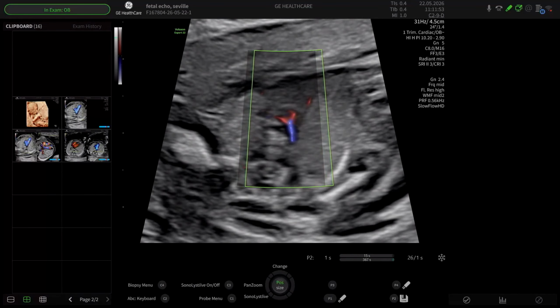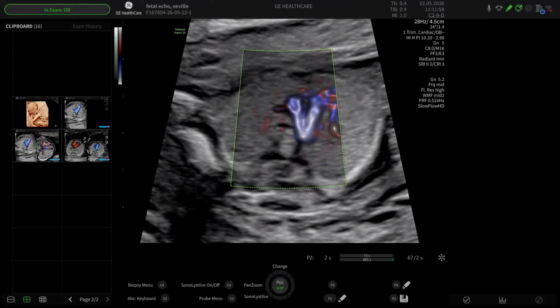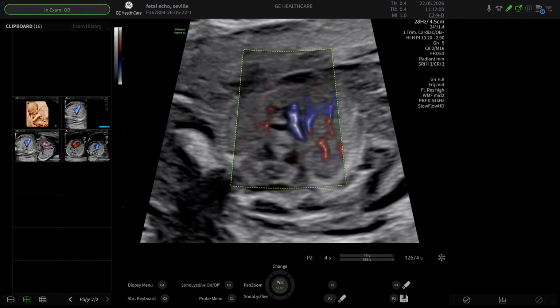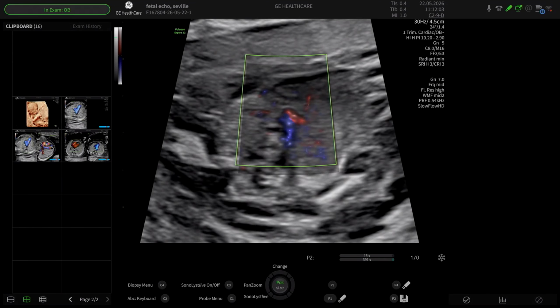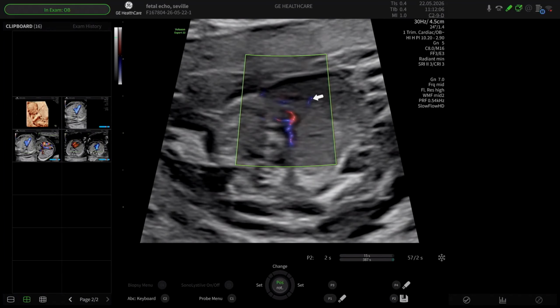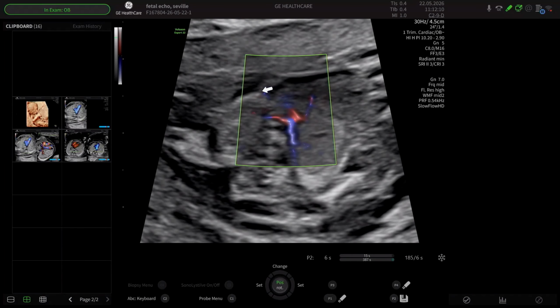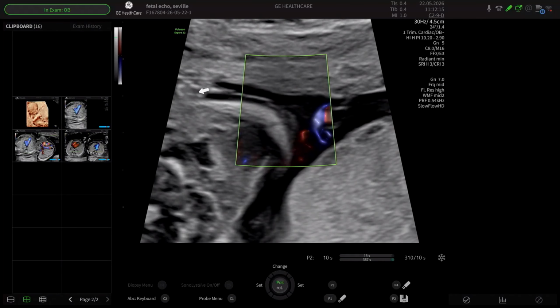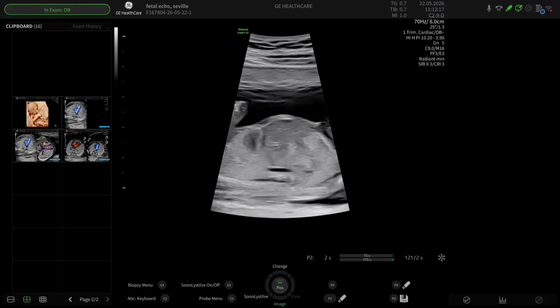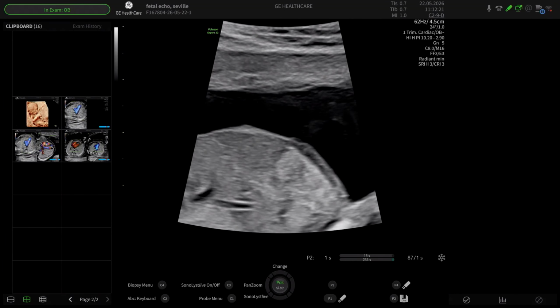This becomes important when I talk tomorrow about systemic venous anomalies. And if I just crank up the gain, then I'll see the azygos vein draining into the SVC. And as I do so, I also am seeing the internal thoracic artery or internal mammary artery. This is the left brachiocephalic vein, and this is the internal mammary artery on the other side. And in this view as well, it's a nice position in a sense of visualizing the systemic venous anatomy.